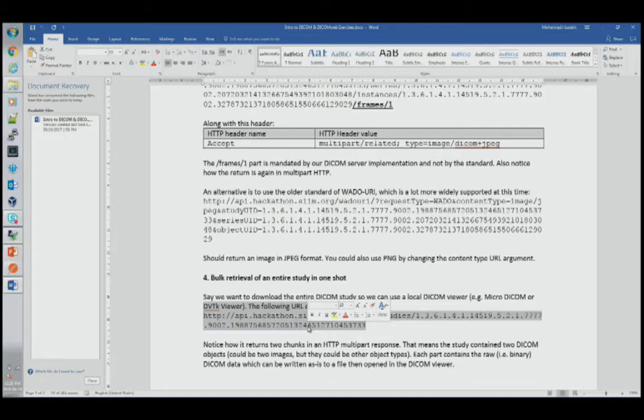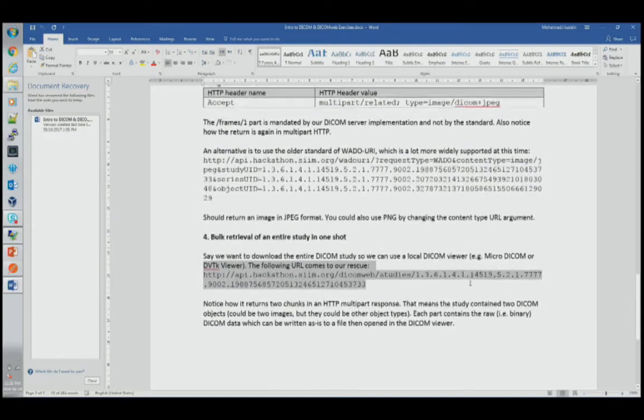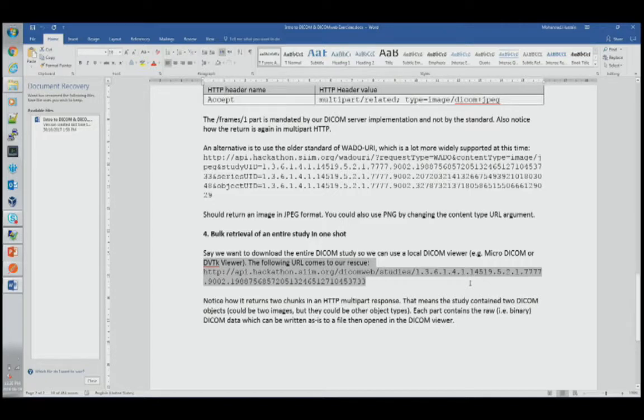I have a quick one. Is there a way in FHIR to reference a study or an observation or some work? How do you do that? Yes, absolutely. Actually, we'll cover that tomorrow. Tomorrow we have a session on FHIR and DICOM, which bridges the two standards. Suffice to say, though, there's a resource called ImagingStudy, in which there's a data type called Endpoint, which is your connection to the DICOM backend to retrieve the images. I will step through the whole thing tomorrow, end to end.